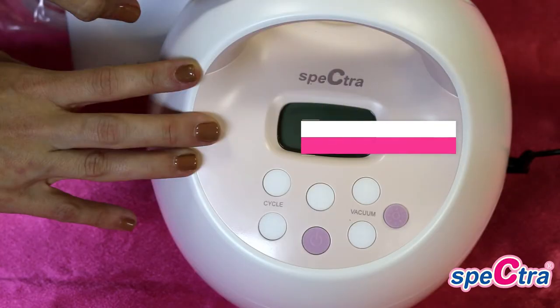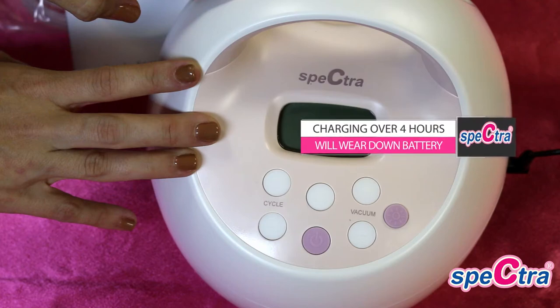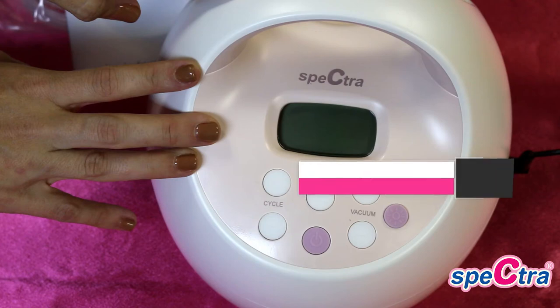If your pump has a rechargeable battery, please make sure to charge for four hours before use. You will not want to charge your pump for more than four hours, as it will wear down the battery. The battery will last for three hours of pumping time.